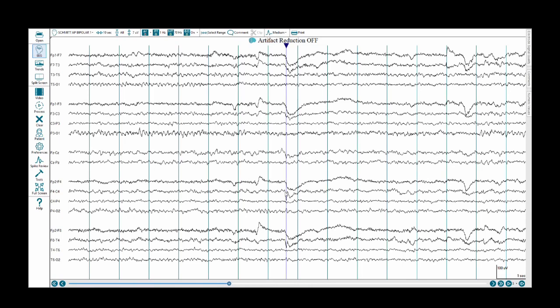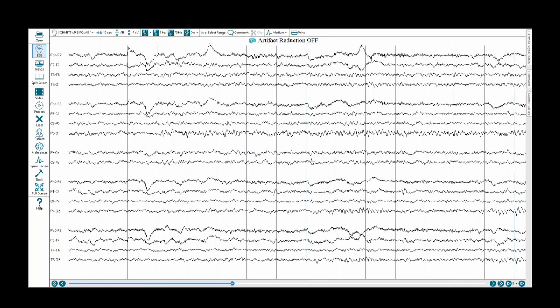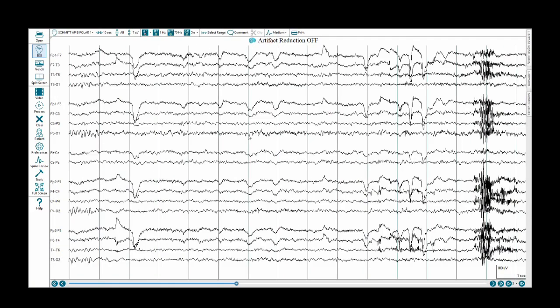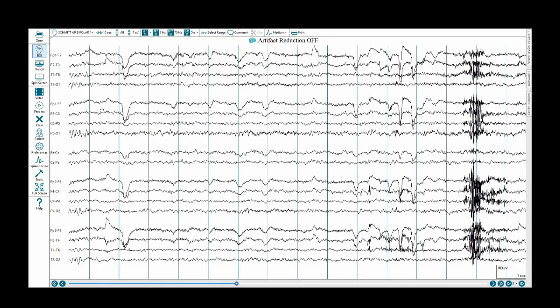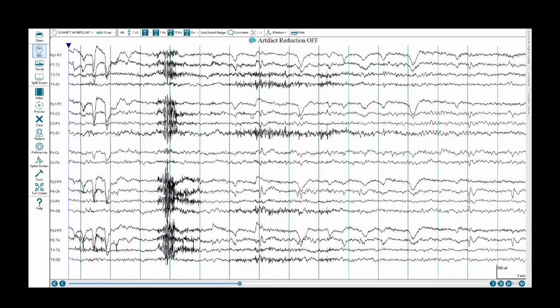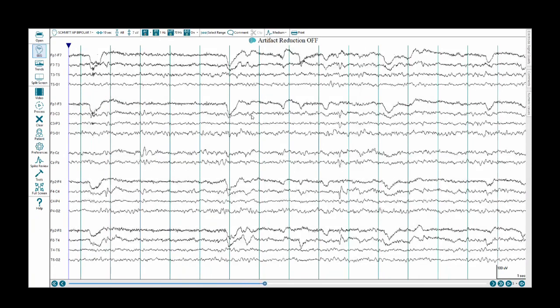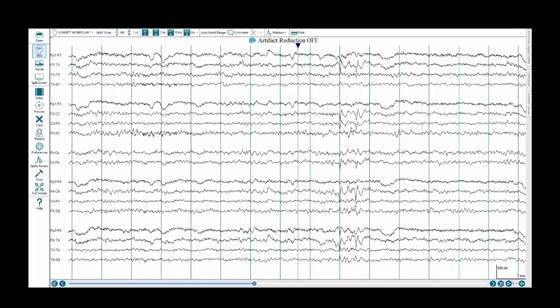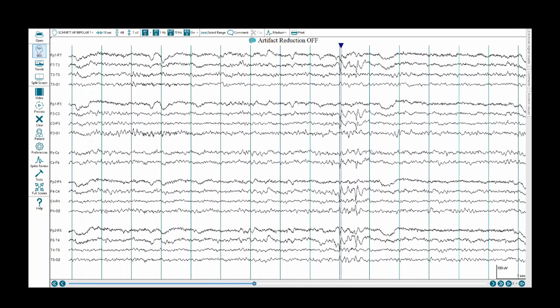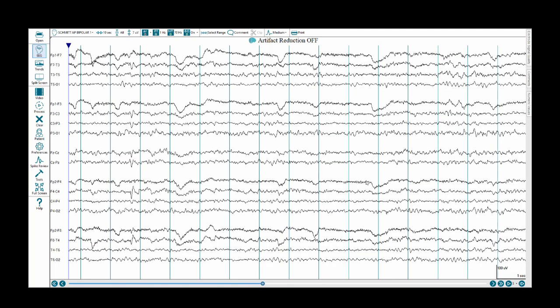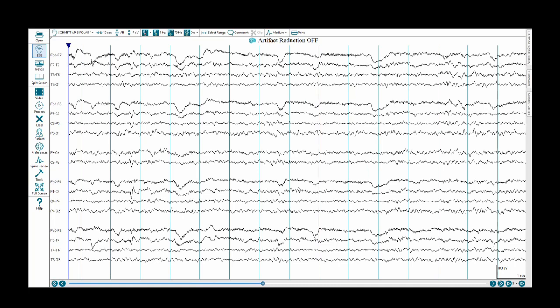Here is another right central parietal temporal discharge. And here are two which quickly follow each other. This particular one is an aftergoing slow wave. So an epileptiform discharge should disrupt the background. Sometimes it's more salient than at other times.